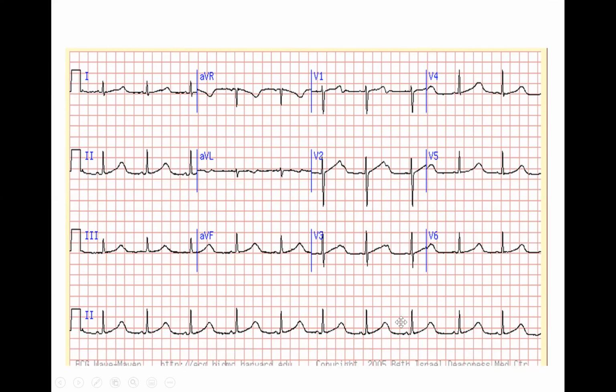So roughly, when your eye hits an ECG, look at the RR interval and draw an imaginary line in the middle. If the QT passes that 50% line, it is prolonged. So by visual assessment, this is prolonged, and of course you can measure it if you wish. So in the setting of a prolonged QT, this second deflection that comes in the T wave, rather than a PAC, it could be a U wave. So how can I differentiate between a U wave and a P wave?